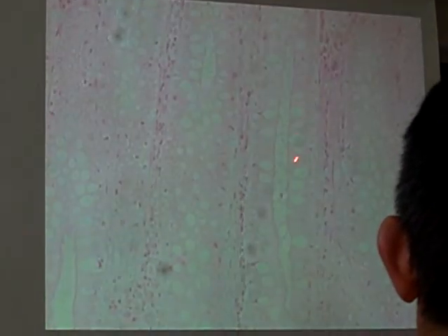This is the epithelium. You see a lot of goblet cells. So the large intestine has a lot of goblet cells, right? These are goblet cells. This is the lamina propria, and then going down, you find the intestinal glands. And this is muscularis mucosa. You can see it's quite thick, right? And then you find those circular muscles. Those are circular muscles, and all the way going down to here, that's longitudinal muscles.